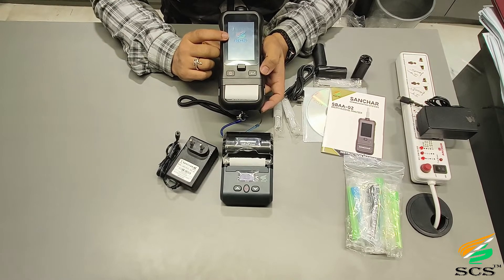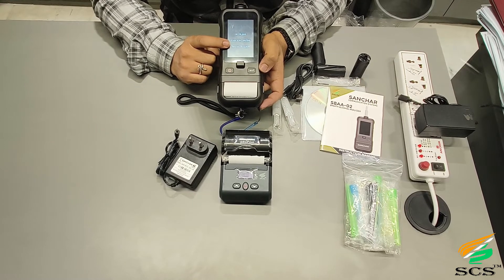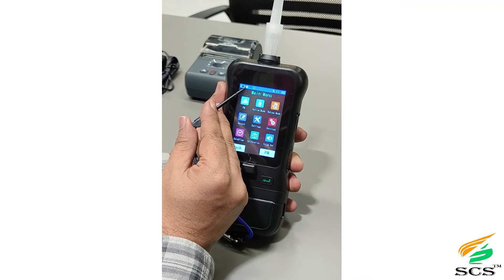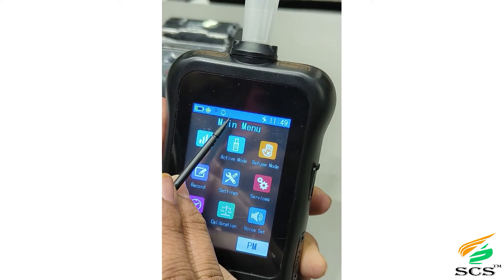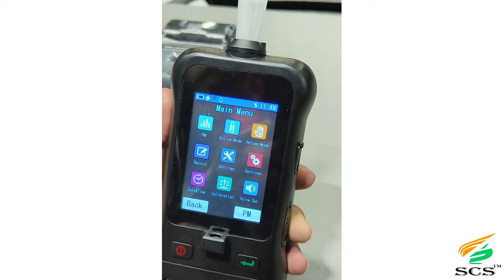After the SCS logo, the device version details and calibration validity details will appear. On the status bar you can see the battery icon, GPS icon, bell icon for sound and silent mode, Bluetooth icon, flashlight icon, and the current time.